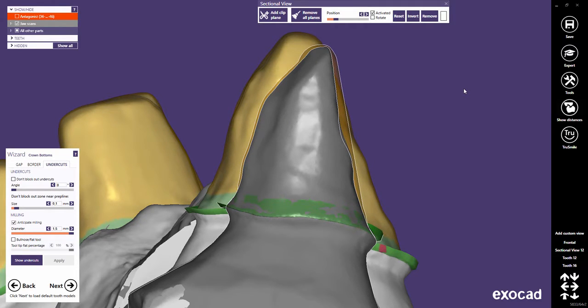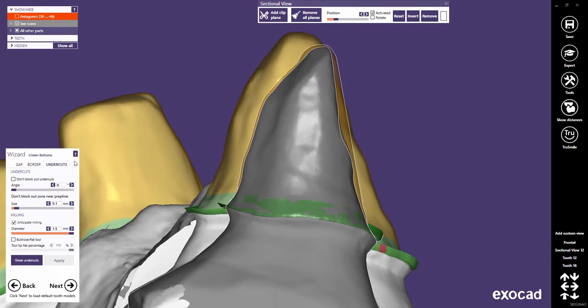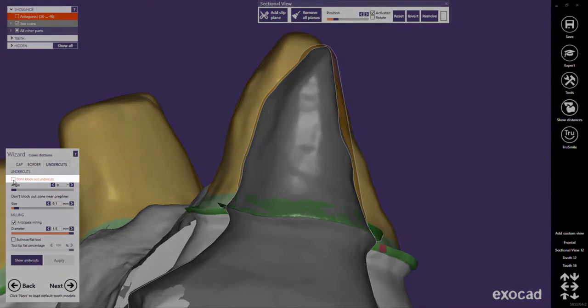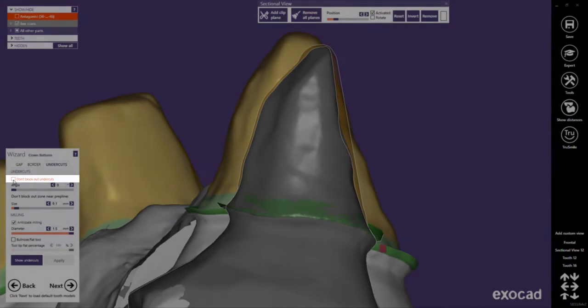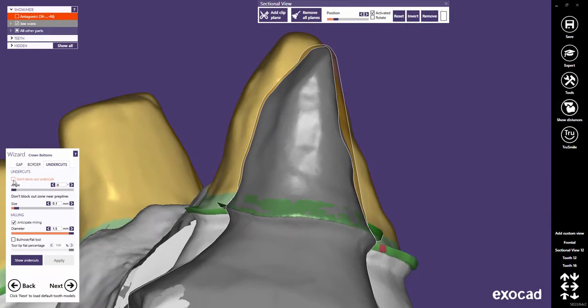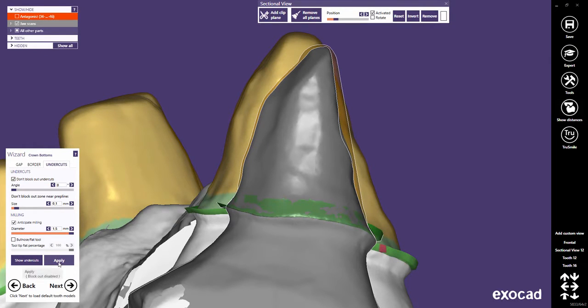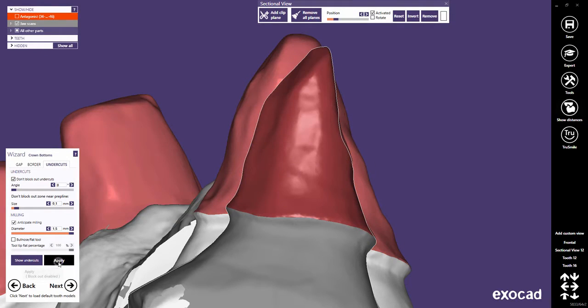Per default, undercuts are blocked out in the preparation unless you check Don't block out undercuts. Note, changes in the undercut settings always have to be applied.